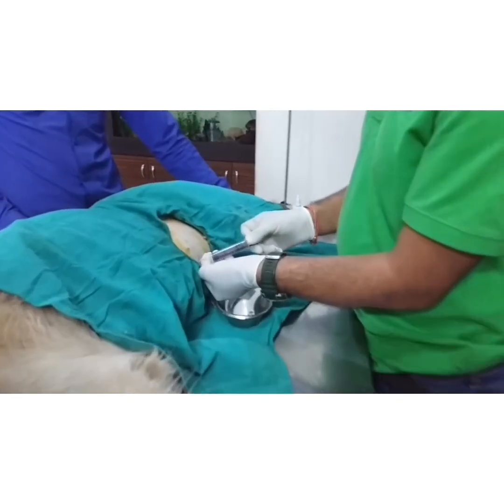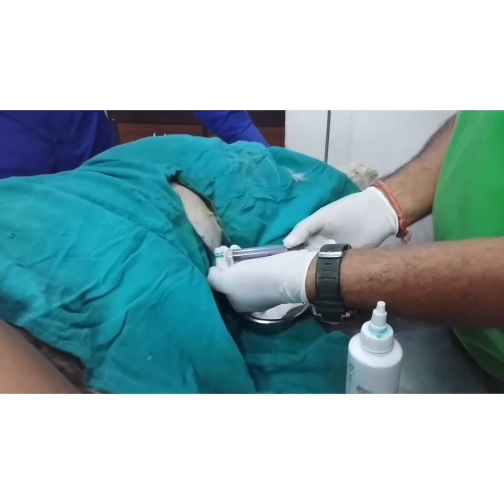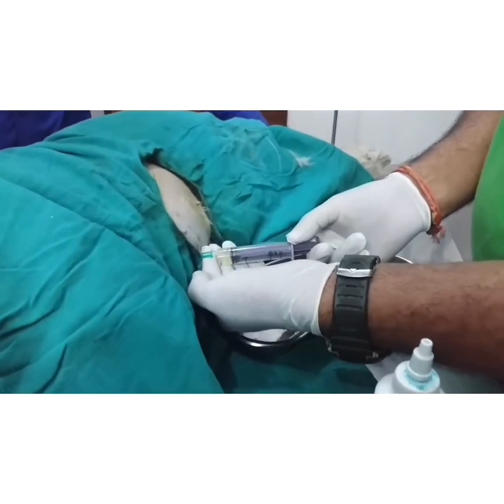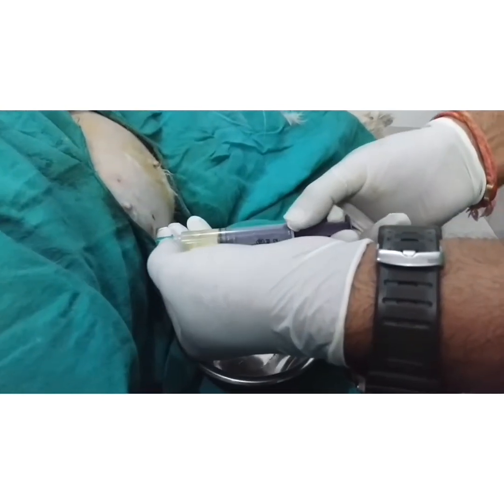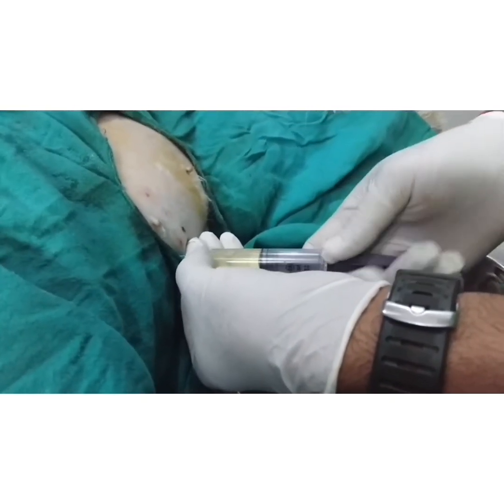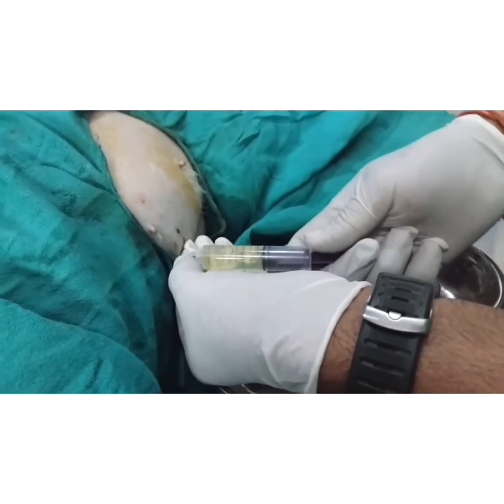I am collecting the fluid. I am showing how to collect the fluid. There is the ascitic fluid which is coming out. I have punctured with the help of sonography guidance.